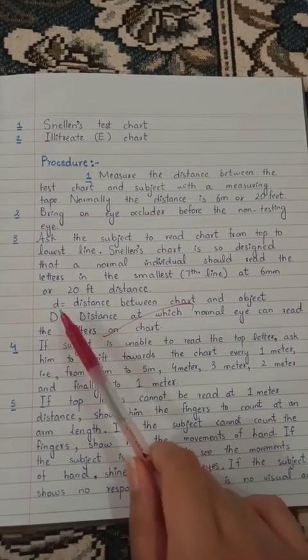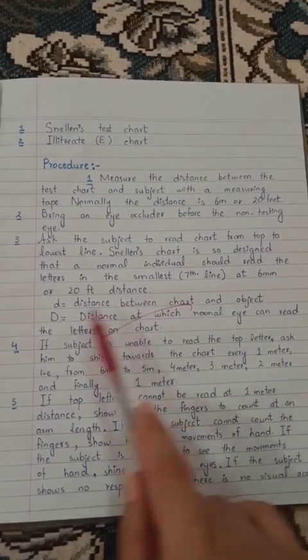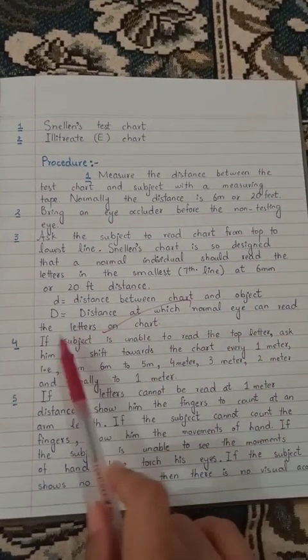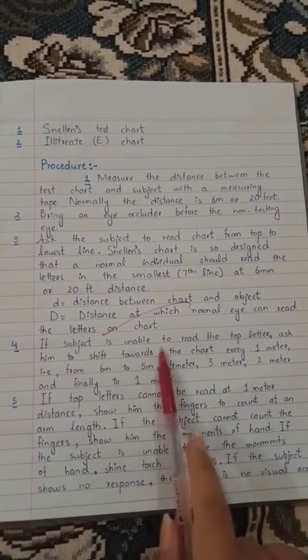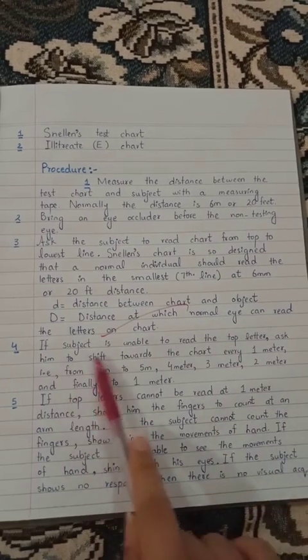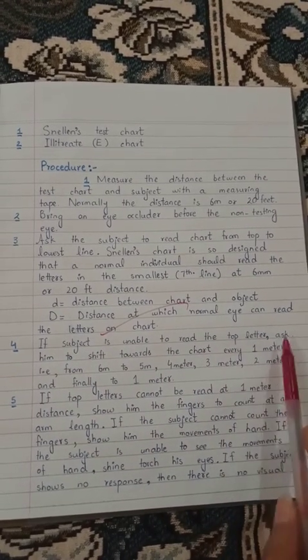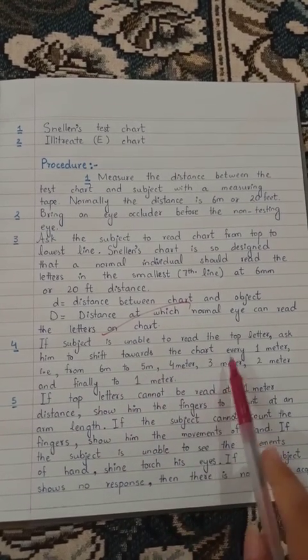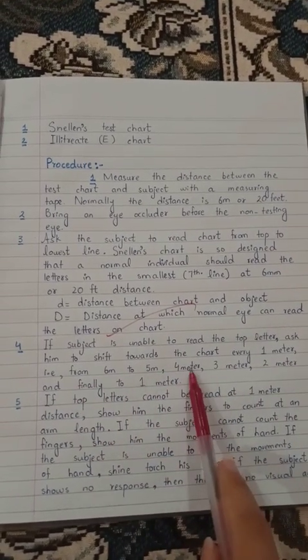Small d is equal to the distance between chart and subject, and capital D is equal to the distance at which a normal eye can read the letters on the chart. If the subject is unable to read the top letter, ask him to shift towards the chart every 1 meter, that is from 6 meter to 5 meter, 4 meter, 3 meter, 2 meter and finally to 1 meter.